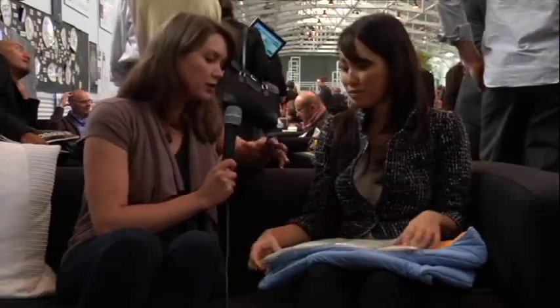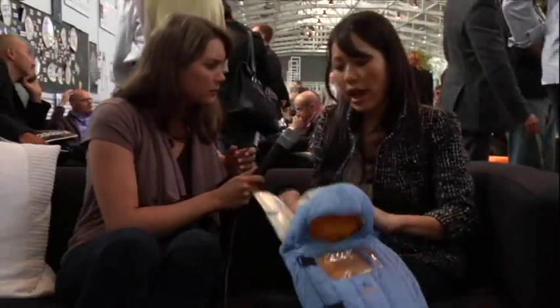So that's a great alternative to, let's say, holding your baby over coals or wrapping hot water warmers around them, I imagine. Exactly. Right now, what parents are doing is just putting a light bulb over the baby, but in every clinic I've been to, I'll hear a story of a light bulb that has shattered over the baby. Or you see parents that tie hot water bottles around their babies' bodies, just hold them over hot coals. So really unsafe, ineffective methods for taking care of these infants.